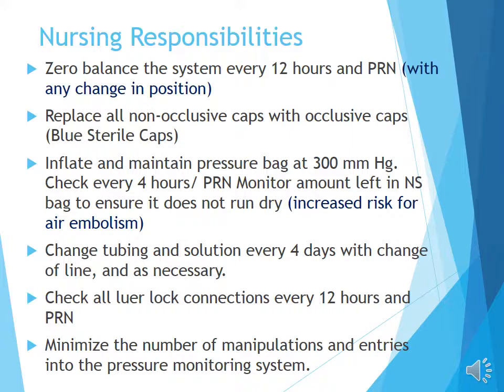So you want to make sure that your pressure bag is inflated at all times and that there is enough fluid in that pressure bag. It makes the patient at increased risk for an air embolism because the bag is pressurized, so if it does run dry and you let air go in, it will go in rapidly and go right into the arterial system, right into the patient's artery in the blood system. So you want to make sure that you do not let that run dry. So check it at least every 4 hours, but I would just go in and kind of peek at it every time you're in the room.